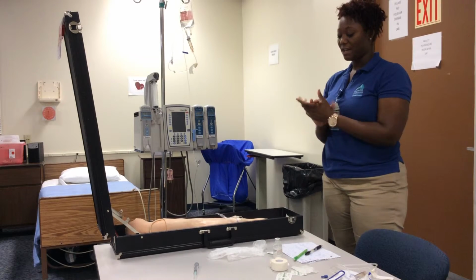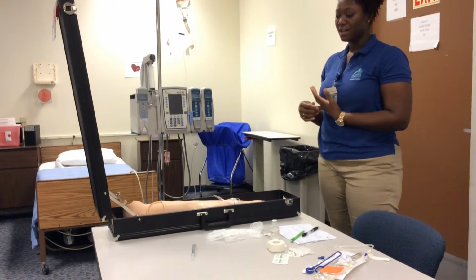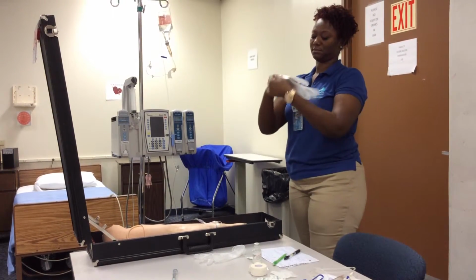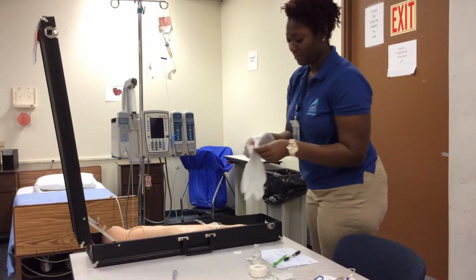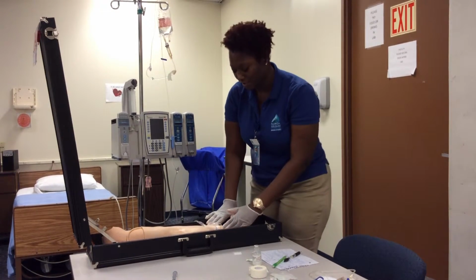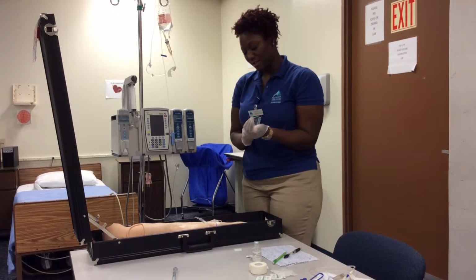So first I'm going to go ahead. Oh, do you have any allergies to any medications? Latex, iodine, shellfish? Okay, good. So now I need to wash my hands and apply my gloves. Alright, so I'm going to be looking at the IV site to make sure there's no phlebitis or infiltration. I'm going to check for any pain, tenderness, swelling, redness, or any leaking. And there's none present.